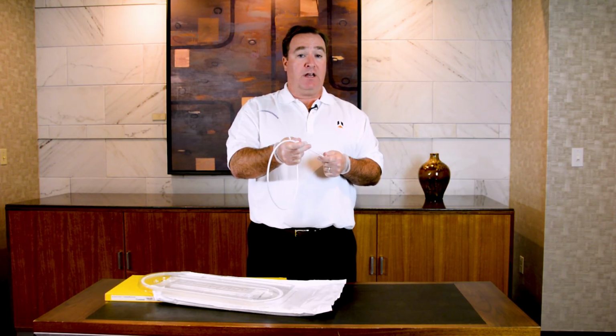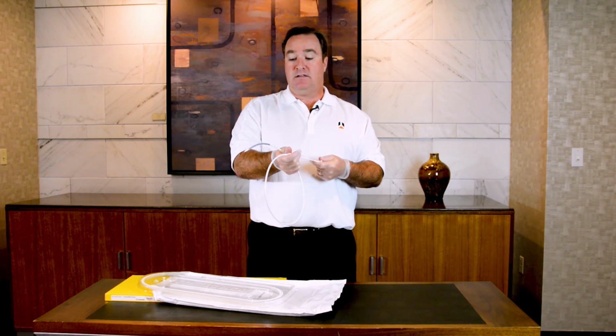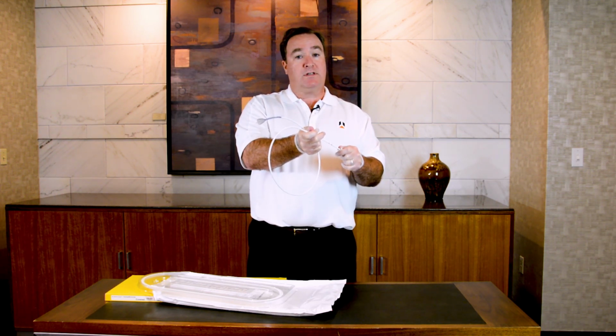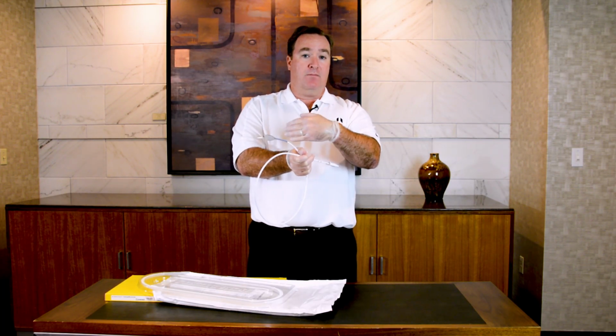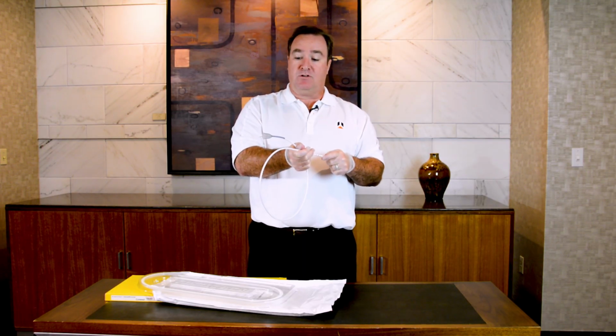Again, it is very key to keep the proximal end of the stent visualized. As you can see here, the stent will move forward slightly as you're deploying. The operator will need to pull the stent catheter back to keep it in the proximal landing zone so that the stent lands correctly.